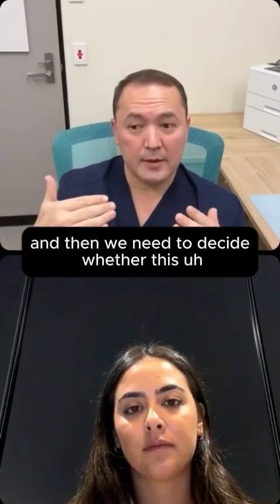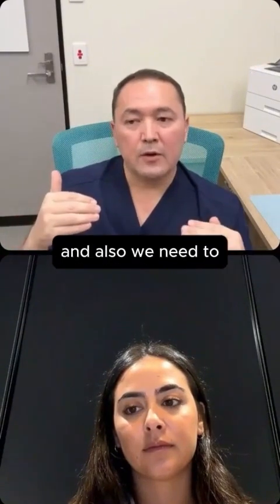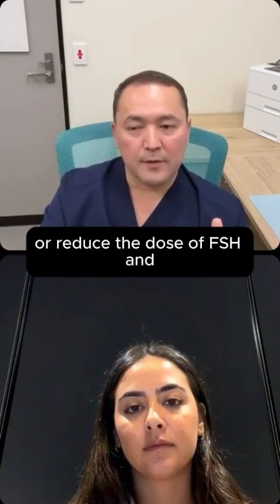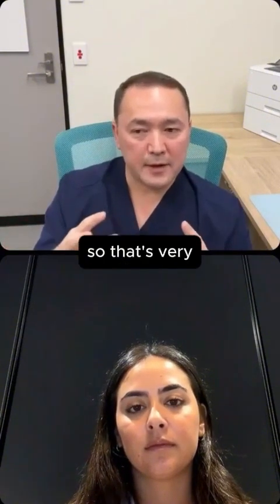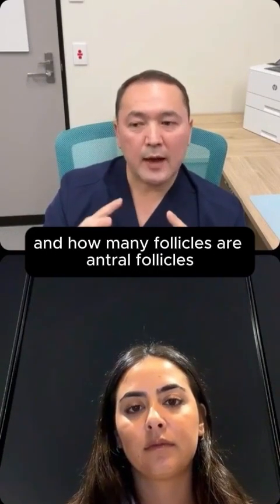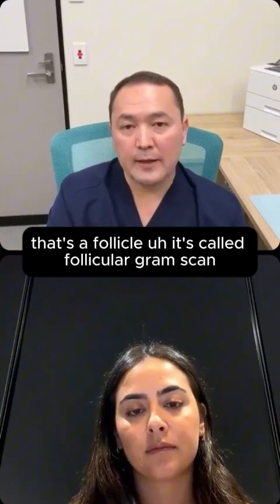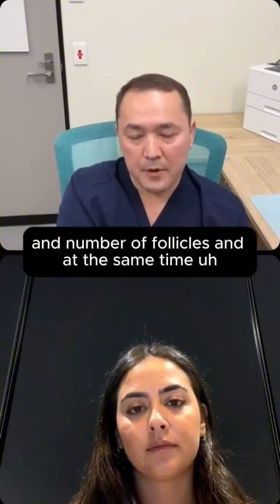And then we need to decide whether these follicles are big enough for triggering or not. We also need to decide whether we should increase the dose of FSH if the follicles are not getting activated, or reduce the dose of FSH, or stop the FSH altogether before we trigger. So it's very critical for us to know the exact size of follicles, how many follicles are growing, and how many are antral follicles which are not growing, on both right and left. It's called a folliculogram scan, which means we are scanning to check follicle sizes and the number of follicles.